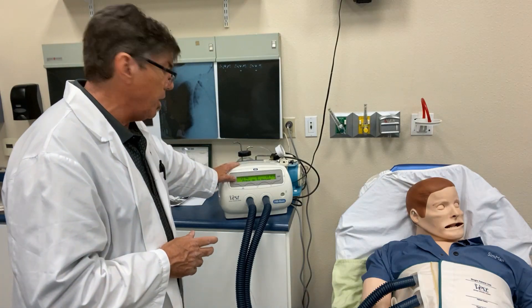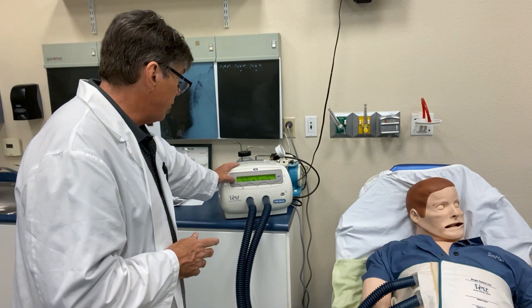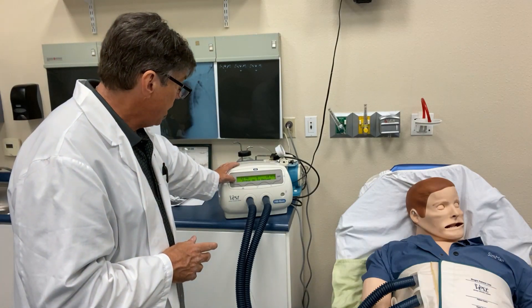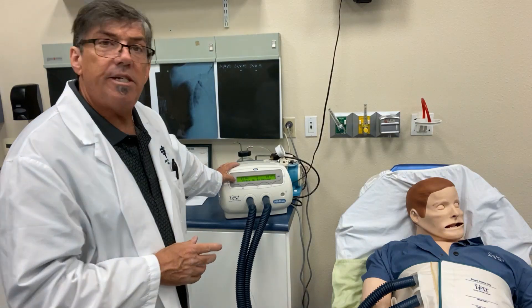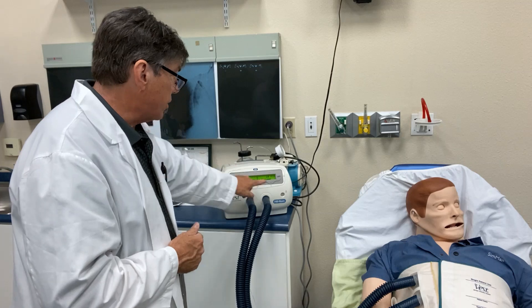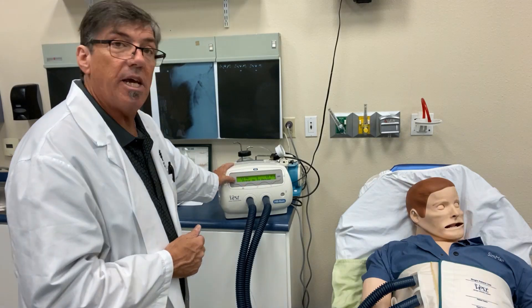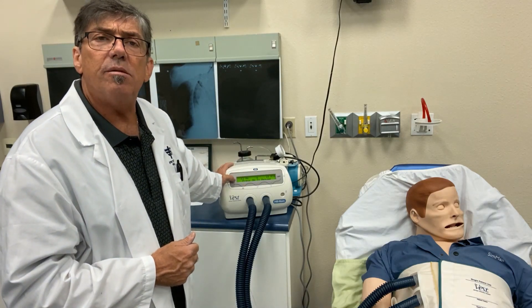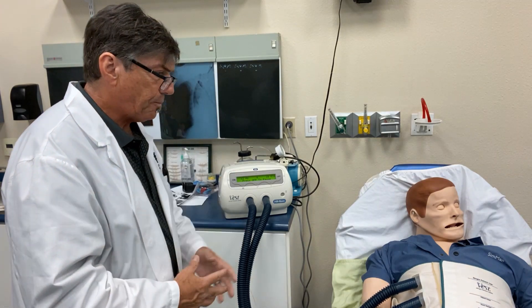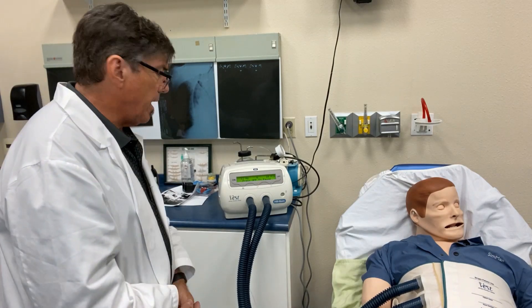I'm going to go ahead and initiate the machine right now at 12 hertz — so that's 12 times 60, giving your total vibration. We've got an intensity of six here, and that's adjustable as well. The therapy time is set at 10 minutes, and in 10 minutes the machine will shut down. Let me show you what that looks like.